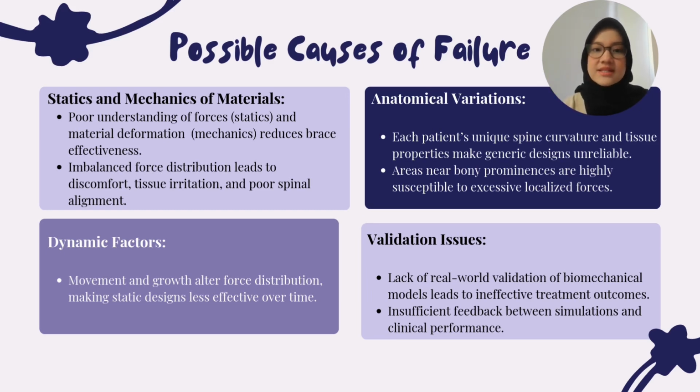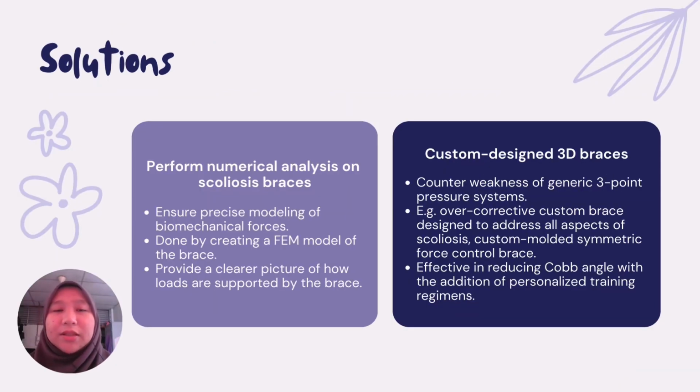And the next one is dynamic factors like movement and growth, which further complicate matters by altering force distribution, making static designs less effective over time. And finally, validation issues arise from limited real-world testing and a lack of feedback between simulations and clinical results, leading to ineffective treatment outcomes. To overcome the existing challenges that were stated before, scoliosis braces should be designed using advanced biomechanical simulations that incorporate patient-specific data, account for dynamic changes, and are validated with clinical outcomes.